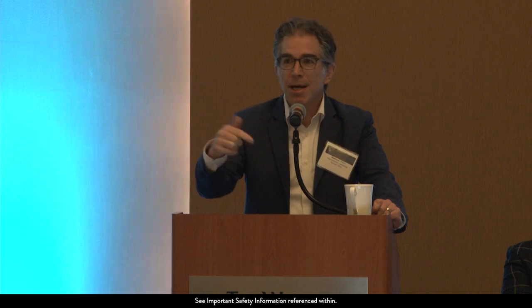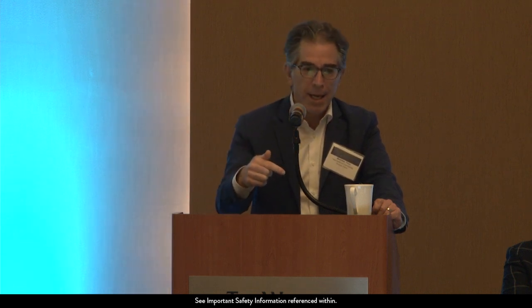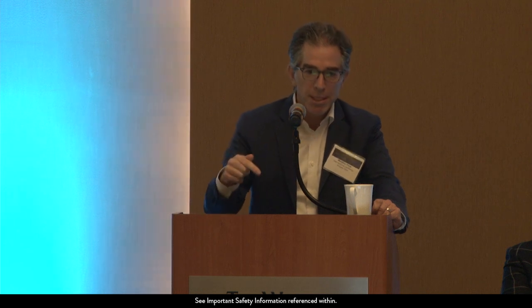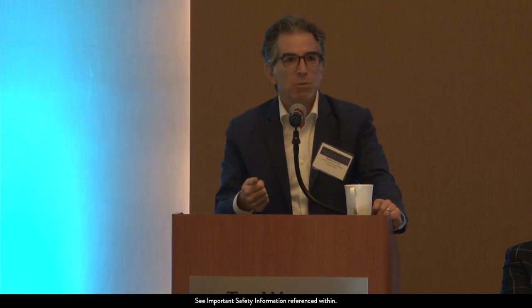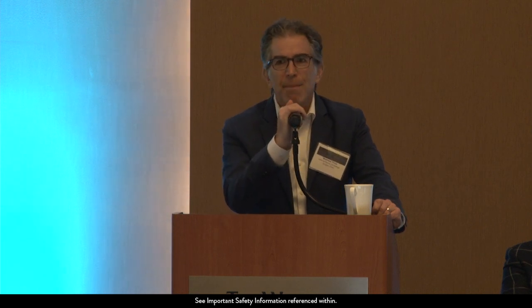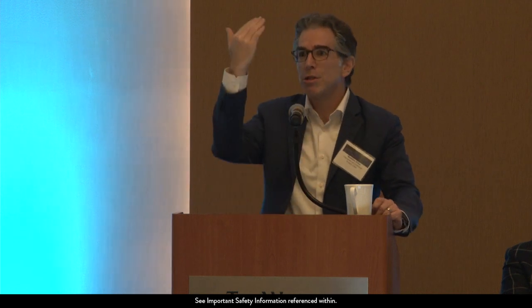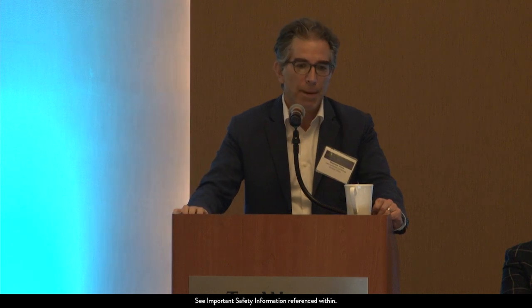And I can tell you, as someone who does a lot of TE, that this is going to be very hard to see on TE. If you did a pre-op TE, the TE doc will say, well, I don't even see an appendage here. I think the patient has like a micro appendage. That's because it's so superior, you don't see it on any of your angles. So here, CT sizing is going to be better.